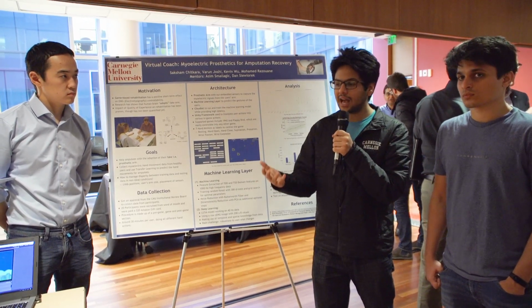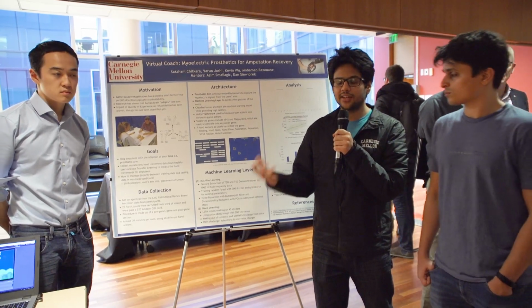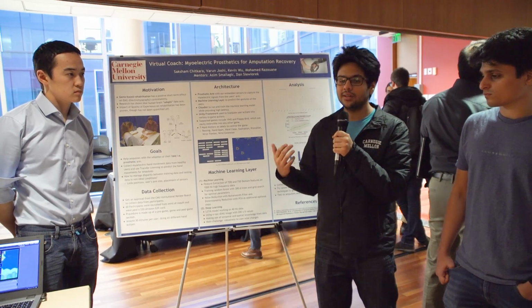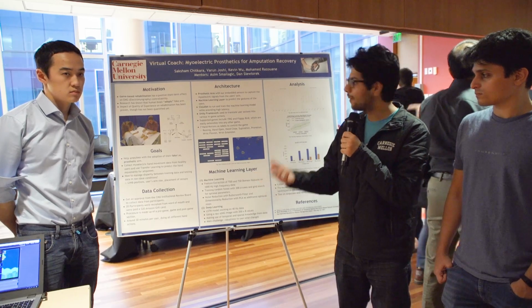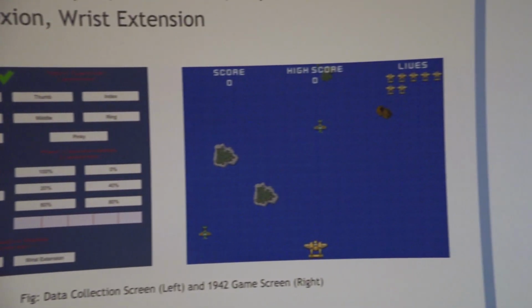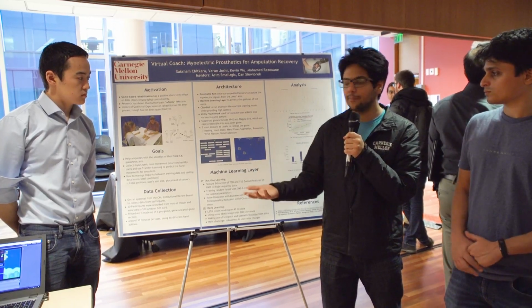So we use edge computing, and our sensors act as a thin client. All the compute happens in the cloudlet, and we just transfer the results back to our sensors where they can be used. And finally, the participants play games like 1942, and it can be extended to Flappy Birds, where they do a bunch of actions controlled by their arm.